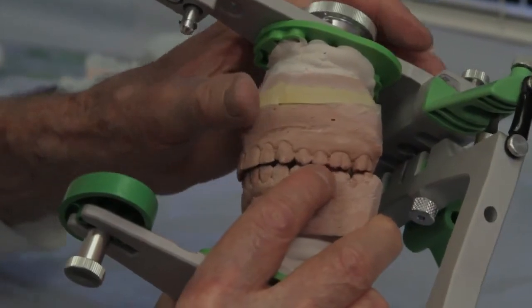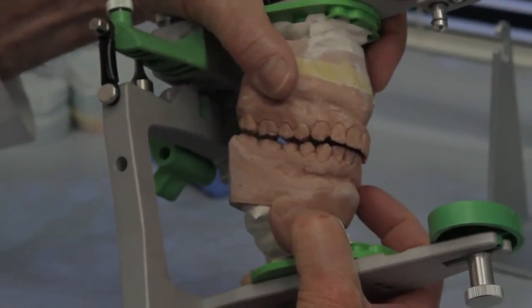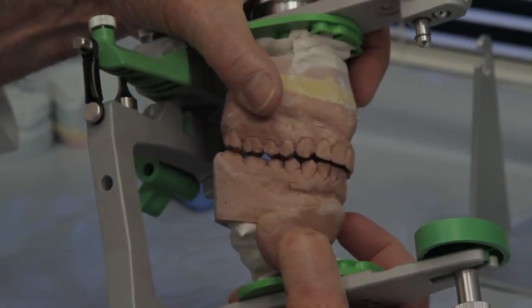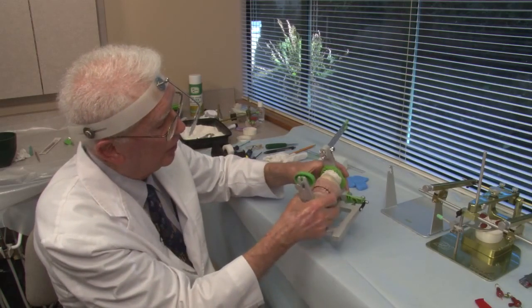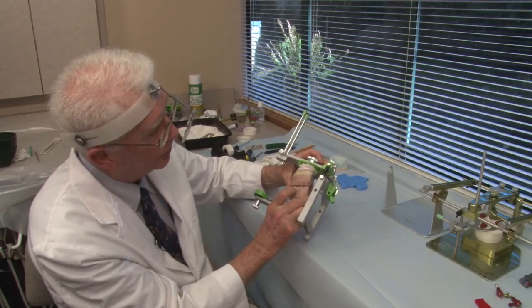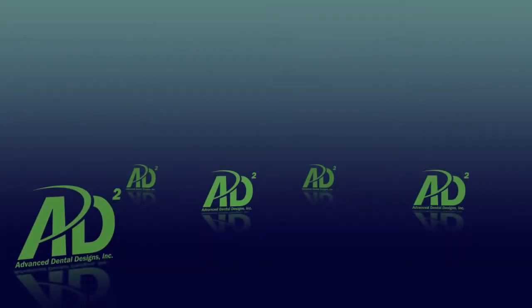And if we go into left working and look at right balancing or orbiting, again you can see the posterior contact on the second molar, the lingual cusp of the upper second molar hitting the buccal cusp of the lower second molar. So she has the balancing interferences. She has an open bite in the front, so there's no anterior disclusion when she tries to go into protrusive, and the posterior teeth are rubbing when she goes into protrusive, see the second molar? That's the way you wear your teeth, and that's the way you damage the joints over time.